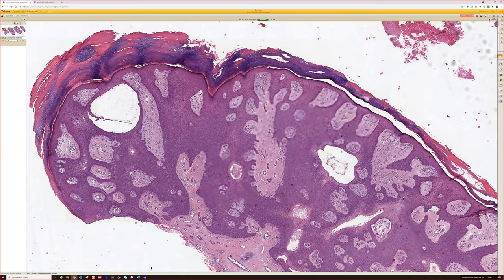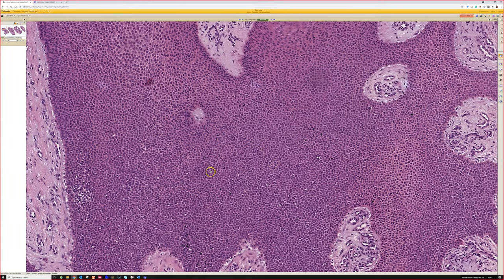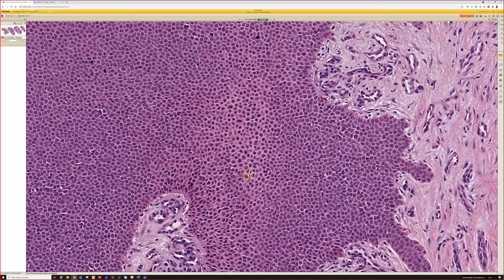Tongues, fingers, whatever. The other thing I like about them, the poroma cells are just perfectly round little monotonous cells. So people call that poroid. They usually do have pinkish cytoplasm, even though they're very round, but it tends to be less abundant, I think, than in hidradenomas.